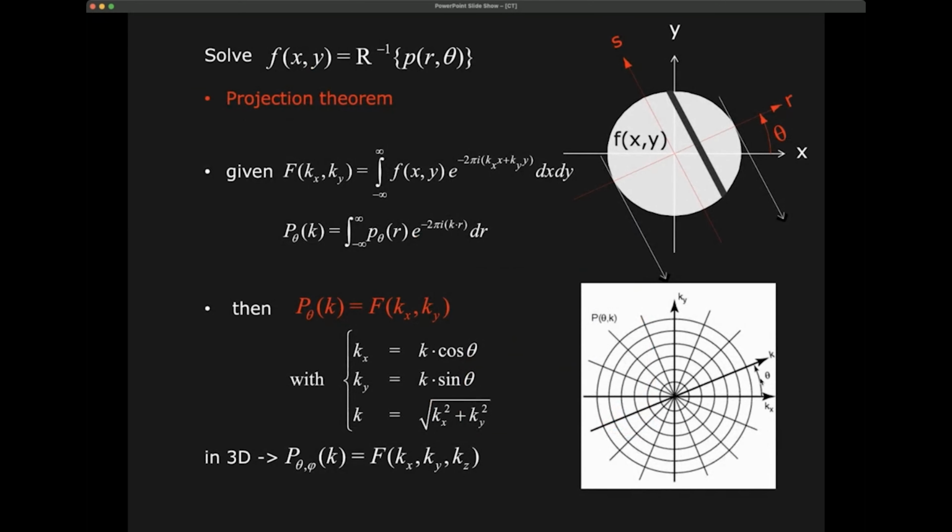So now we're going to see whether there are other ways to do the reconstruction. Instead of just doing this back projection, where we have the disadvantage that it's being smeared out, can we do it in different ways? Can we find ways to make this more accurate or more efficient?